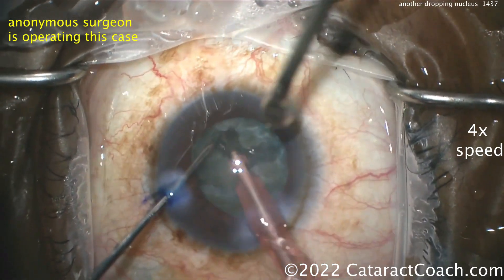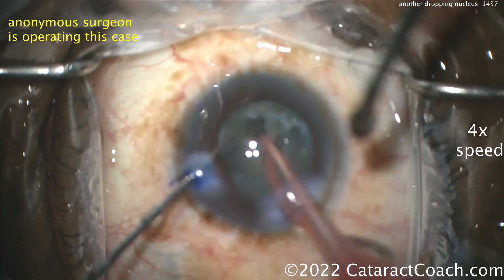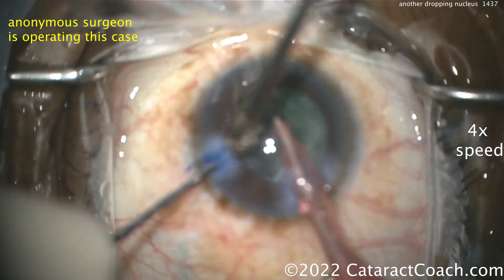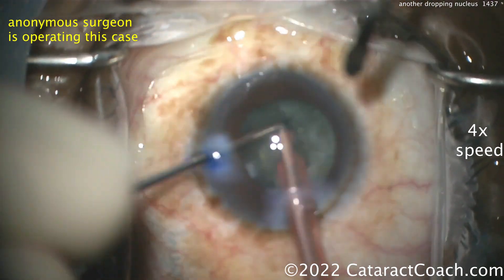Remember, it's not always your fault — it's not always an iatrogenic issue. What if the patient had bad trauma? What if the patient had an intravitreal injection which damaged the zonules? What if the patient has a posterior polar cataract? What if the patient has terrible zonular support? There are all kinds of reasons. The key is: how do you react to it?